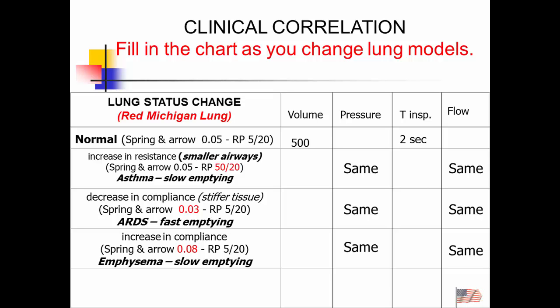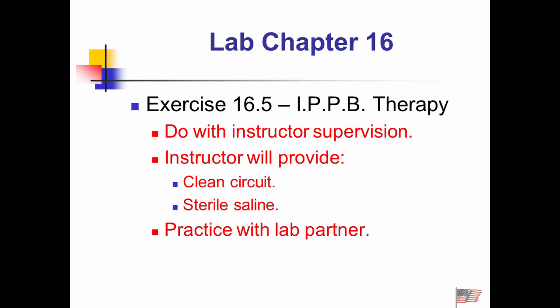This is just when we go through the process, we'll go through and see what happens if I have a higher resistance, a loss of compliance, or an increase in compliance. What happens in each instance to what volume is delivered. And hopefully that will solidify a little bit about what's going on here.